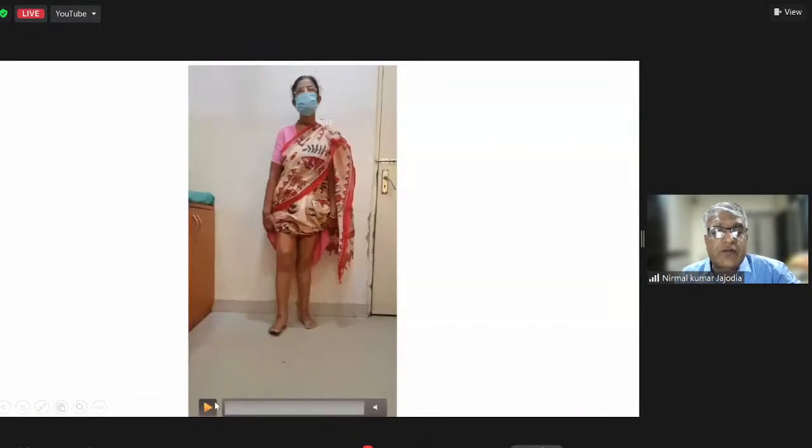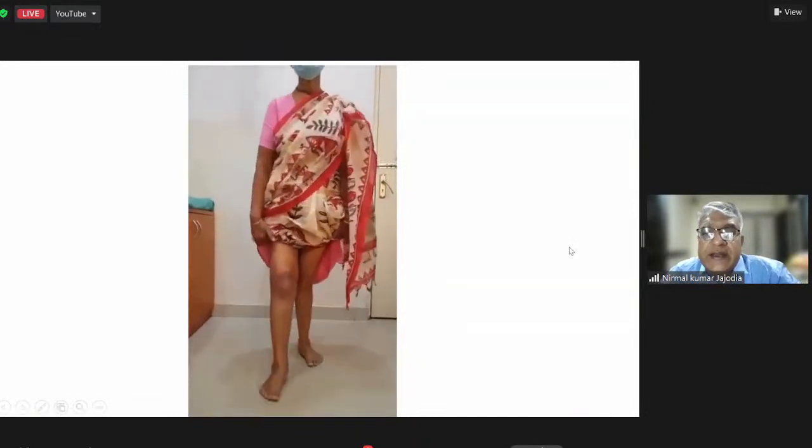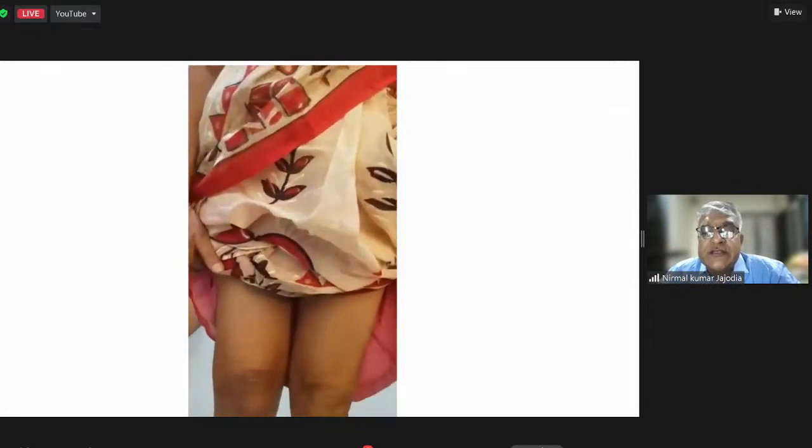And that is the post-operative walking video at 3 months on the patient. The left knee is still due for another surgery. The right knee is completely balanced. There is no thrust and no instability on walking.